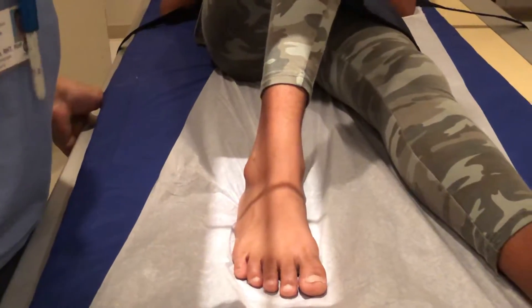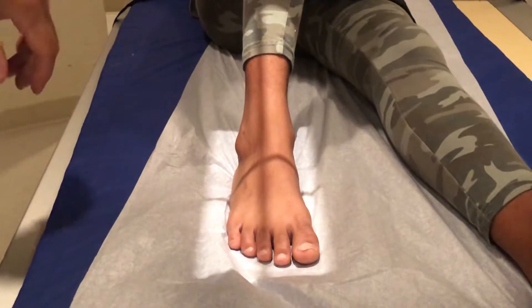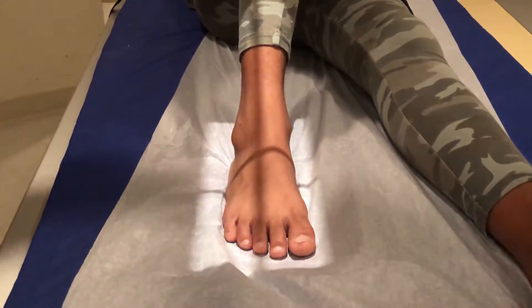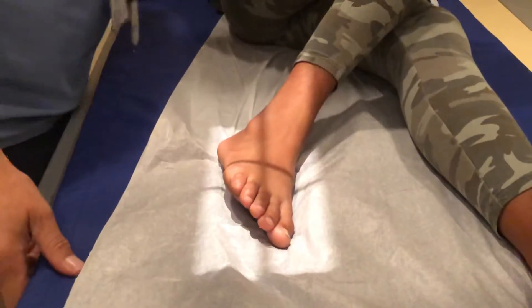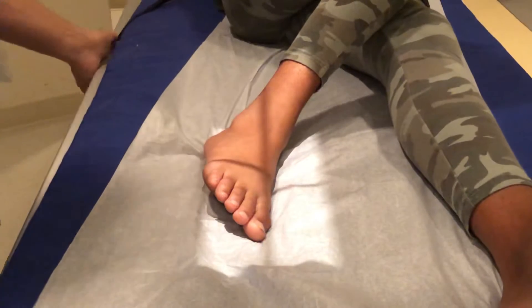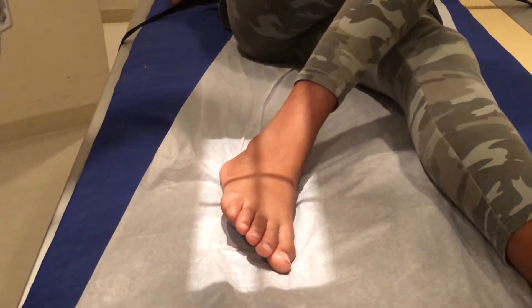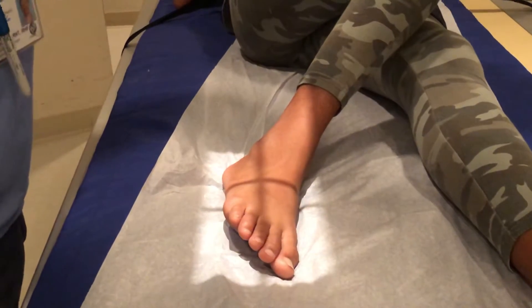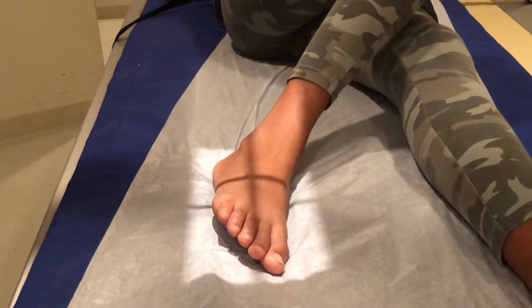Mark what you need to mark and then shoot the x-ray. The second position for the foot x-ray is going to be an oblique. You want to go about 30 degrees in and again center right over the proximal metatarsals. That'll be the second one.